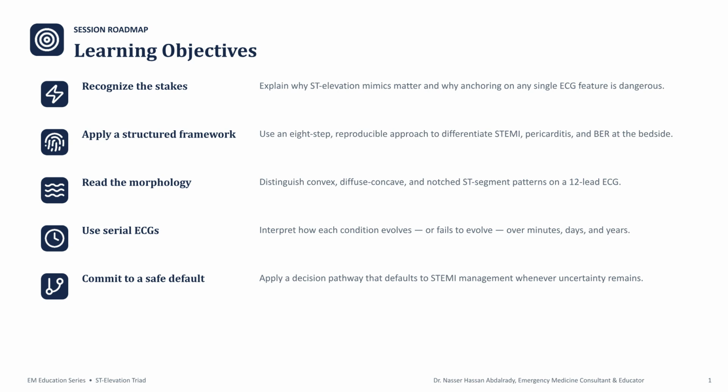In this video, we will learn how to recognize the clinical stakes of ST elevation mimics. We will apply a structured, 8-step framework to help differentiate these conditions, read morphology patterns, use serial ECGs, and commit to a safe clinical default.